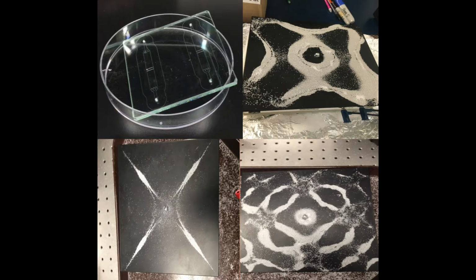Our performance specifications were as follows. Focusing down the midline of the pillars in our microfluidic channel indicates successful performance. We saw this in the microfluidic channels we fabricated and tested. Although this was not a strict requirement or expectation, we hope to see focusing of beads at a flow rate rather than just in static fluid.